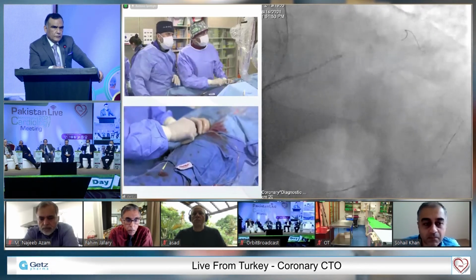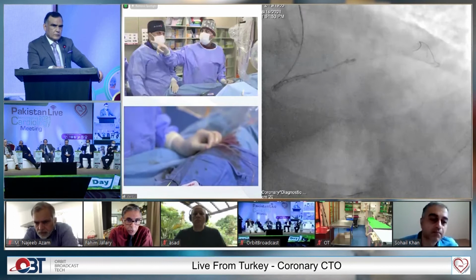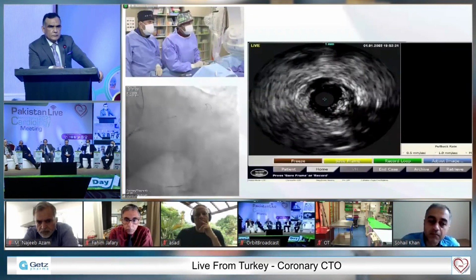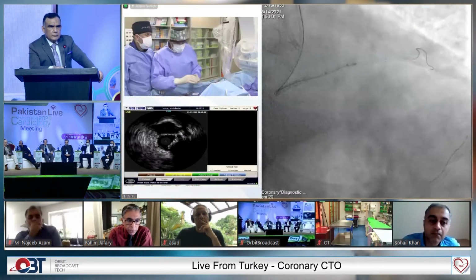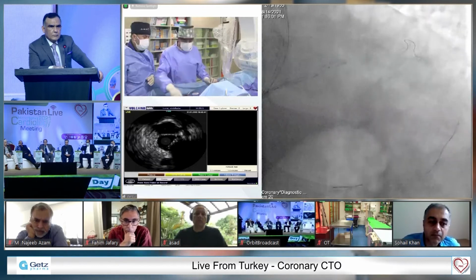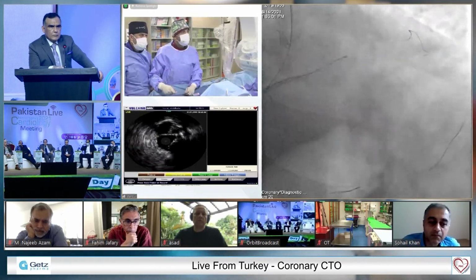Yes. Are you able to show the IVUS? Yes, that's great. No, if you flip them. So you see the IVUS now. That's good. Pull my Fine Cross a little bit back, right, to search. And now try to go to the LAD.